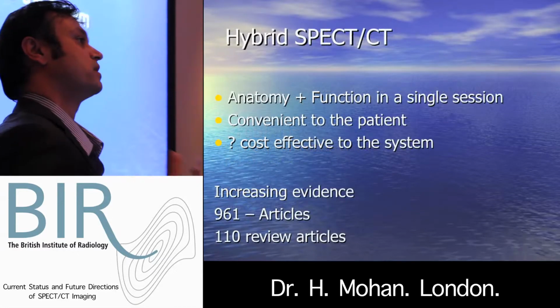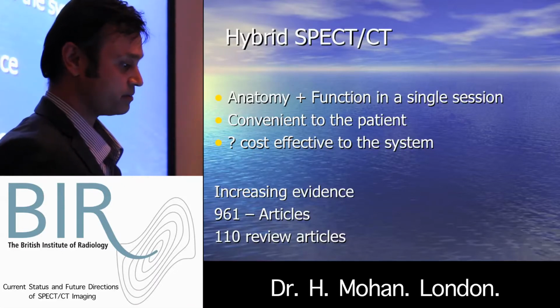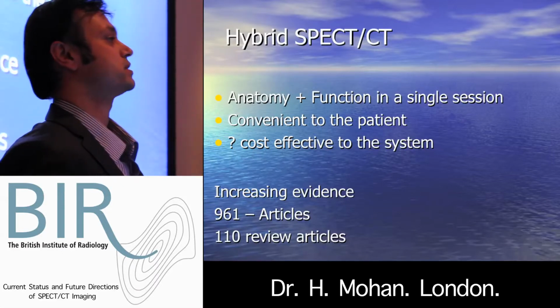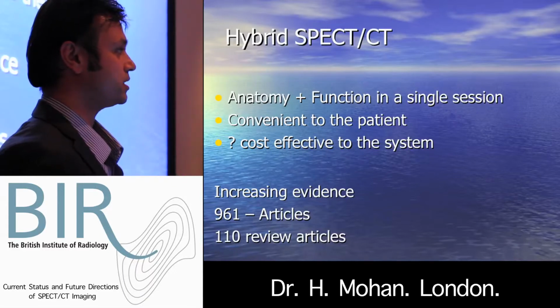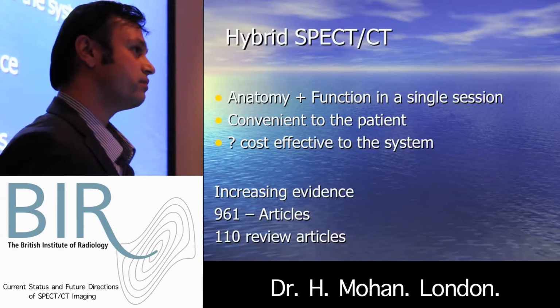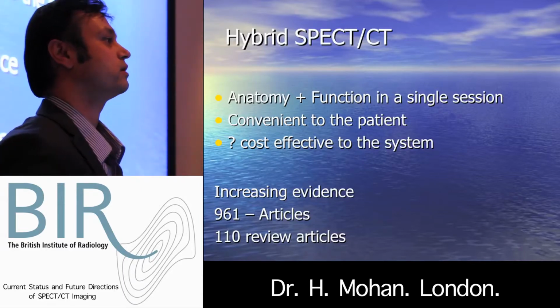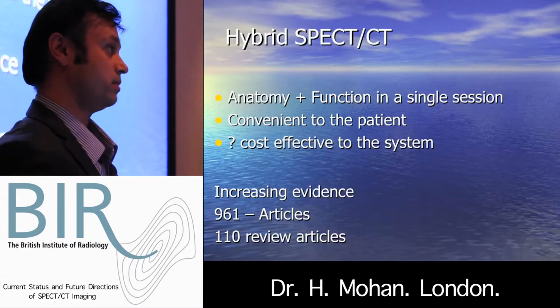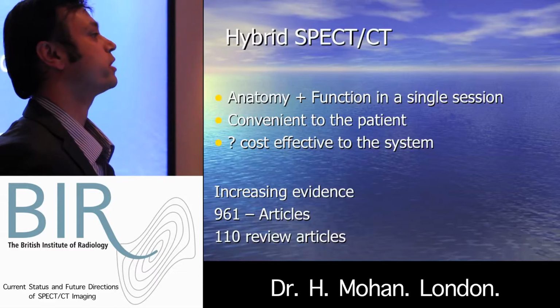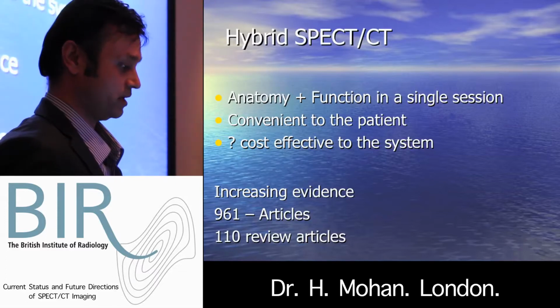So obviously, SPECT CT would probably provide the best answer here then. It combines anatomy with function elegantly in a single sitting for the patient. So from a patient convenience point of view, excellent. The patient does not have to run back and forth for various techniques. And of course, it may prove to be cost effective to the system, because you're trying to answer it in one sitting rather than having to come back for various other techniques.